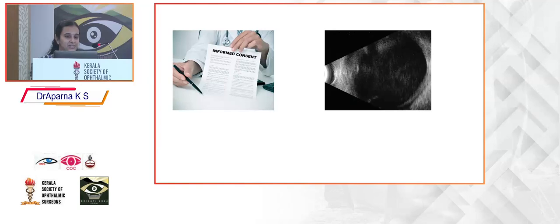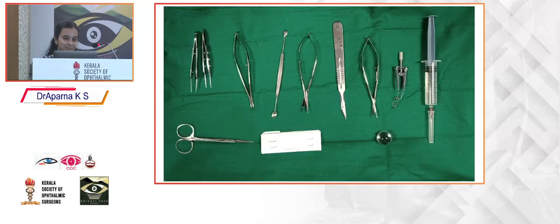Before starting the procedure, always make sure that the informed consent is signed by the patient as well as by the bystander, explaining the nil visual prognosis of the condition in their own mother tongue. And always take a B scan for diagnosis, for documentation, and to rule out any intraocular malignancy.